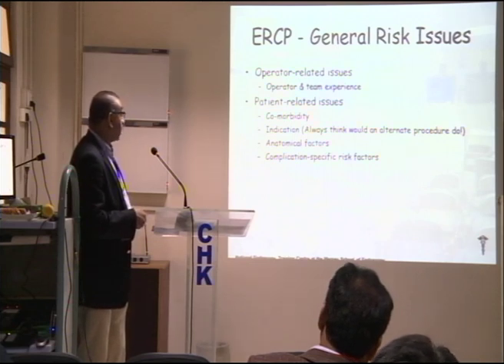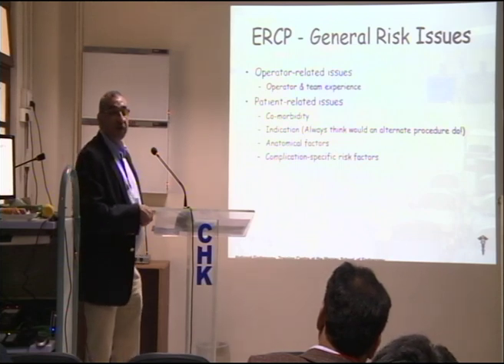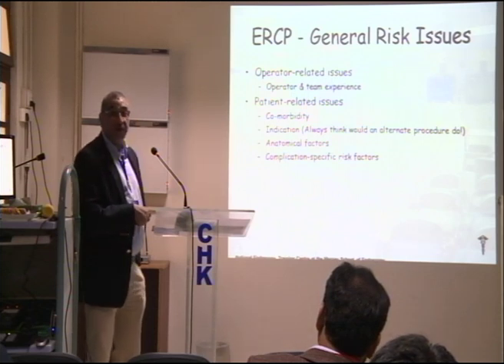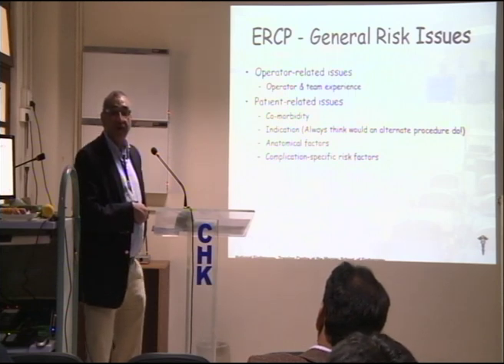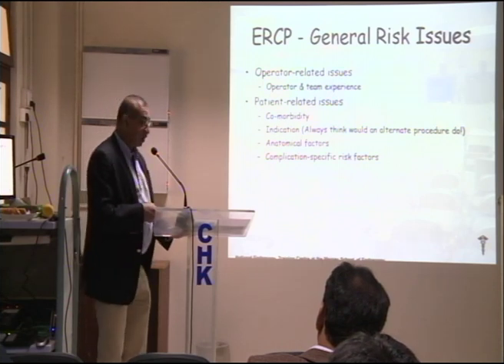Sometimes we do ERCP on fairly frail elderly patients because that may be the only palliative procedure that you can offer them, but you have to be very selective. It is going to help them, but you do not want to be the cause of their death. So always select your patients carefully.